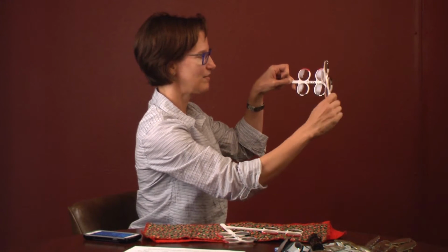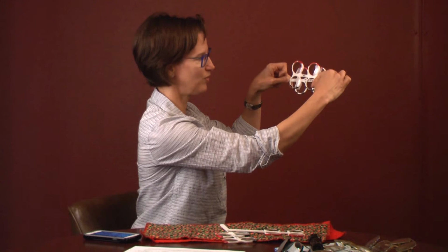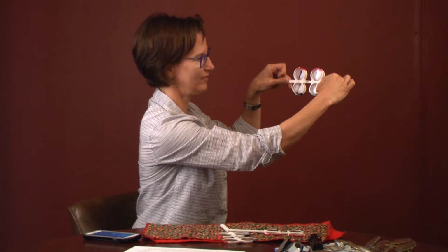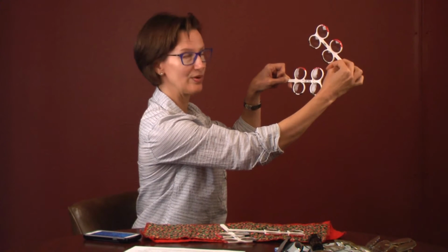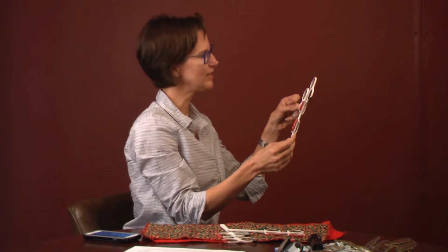If they like the 3 better, but they didn't like the 4, that was too strong, then you can add that positive 0.5 to it to give them a 3.5, and see which one they like better, with just the 3 or with the 3.5. So you're just fine-tuning a little bit.